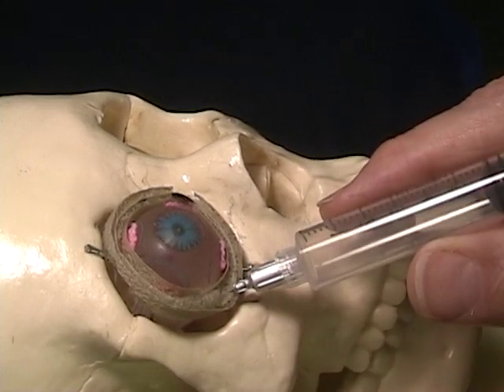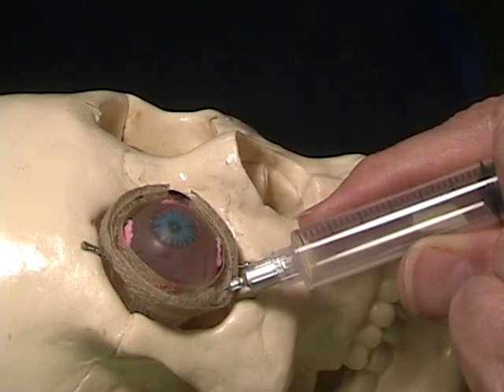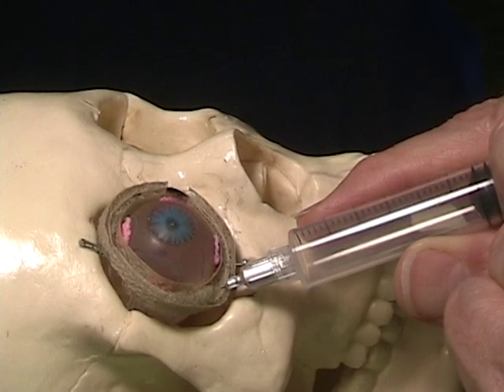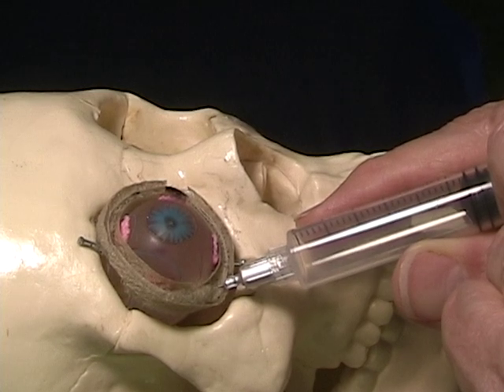Once we've reached that 1-inch depth, we can secure the syringe, aspirate, and begin a slow injection of approximately 1 milliliter every 10 seconds.